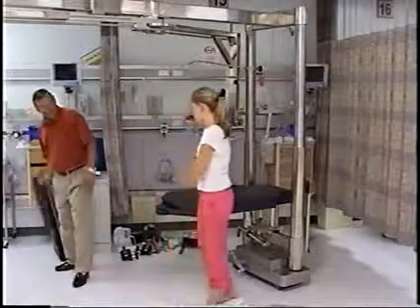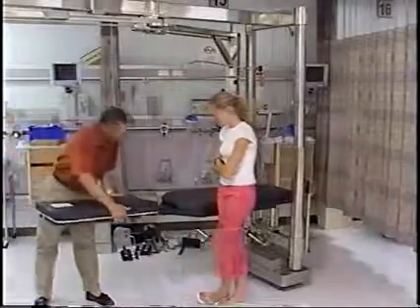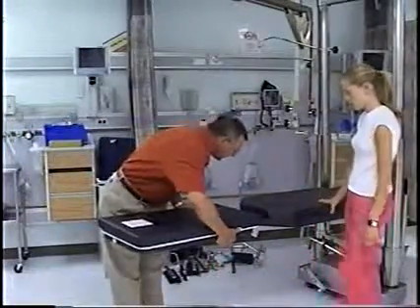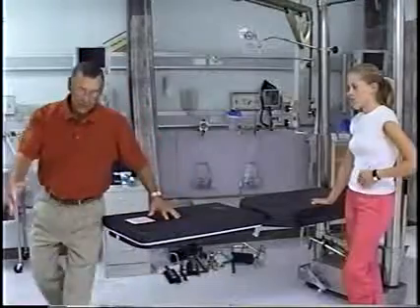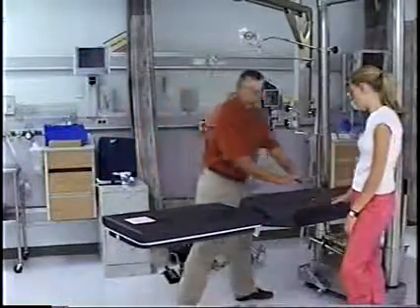Great, she says. This is a well leg support. It should be on the table before the patient comes in. So the stretcher comes in and the patient is transferred to here.